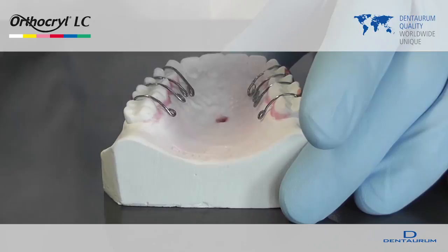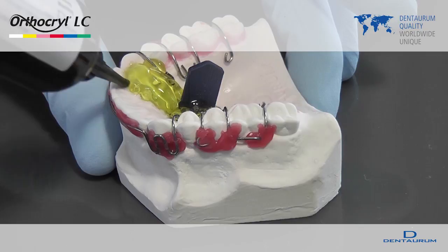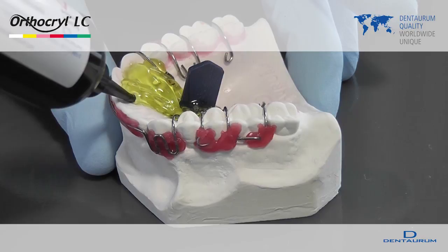The expansion screw is completely surrounded with OrthoKryl LC. It is important that the expansion screw is completely embedded in the acrylic and that no air bubbles form. The expansion screw is then inserted back into the hole that is lined with wax.